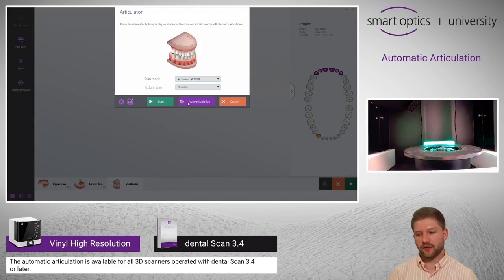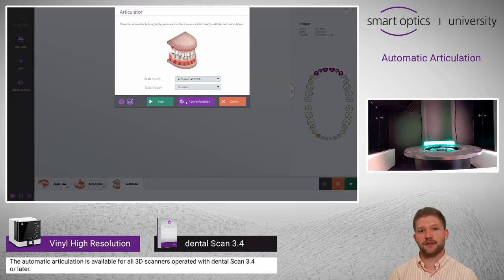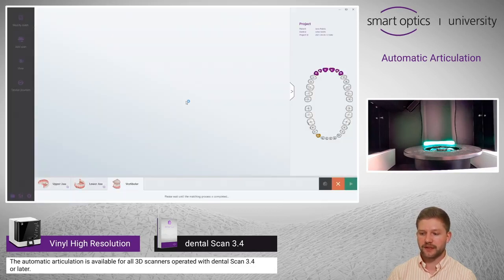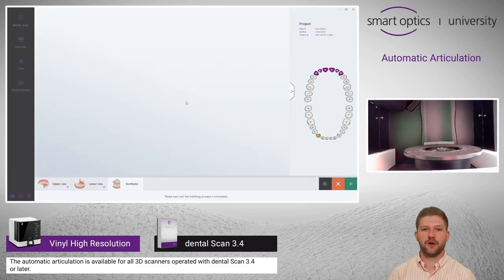You can see a new button over here which is called auto articulation. We have developed a special algorithm which finds the perfect occlusion. I just press the button right here and I don't have to perform an additional scan for the vestibular.